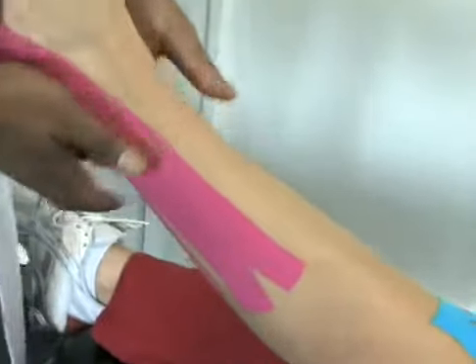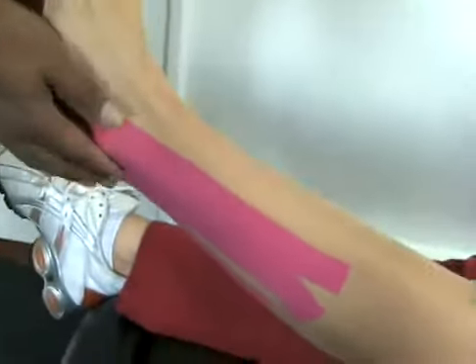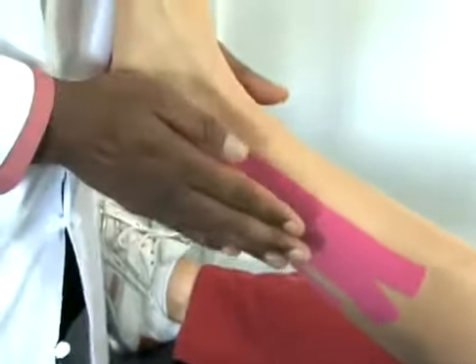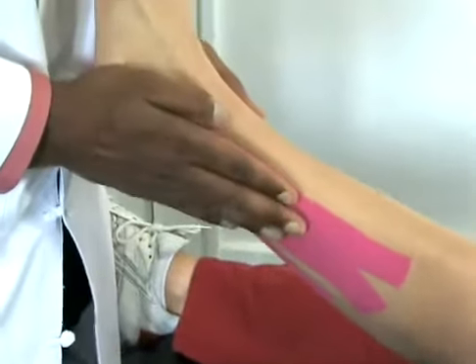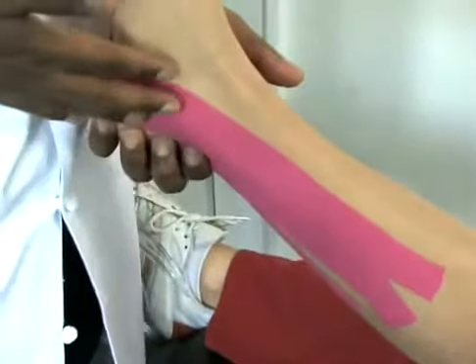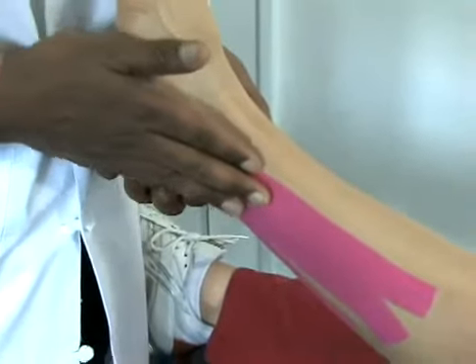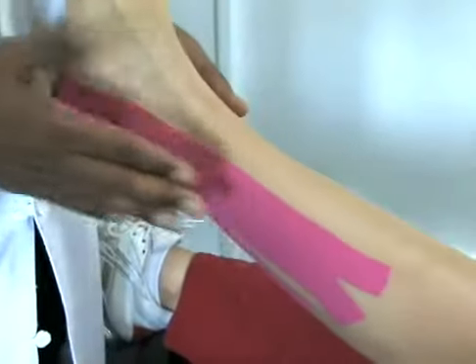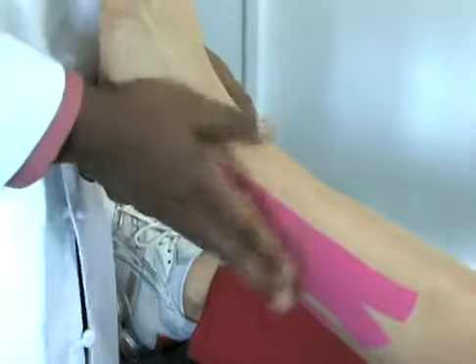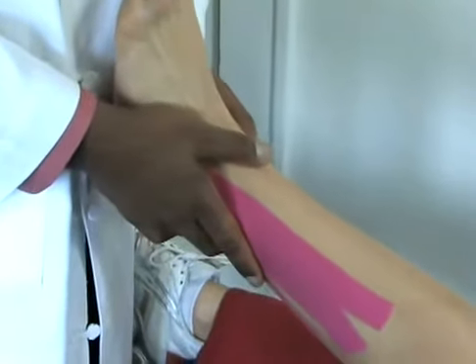So for a sprained ankle, Kinesio Tape allows the skin to just slightly lift along here, and for you, the patient, to get drainage through here so we can decrease the swelling and get you back to running, walking, or your sport of choice faster.